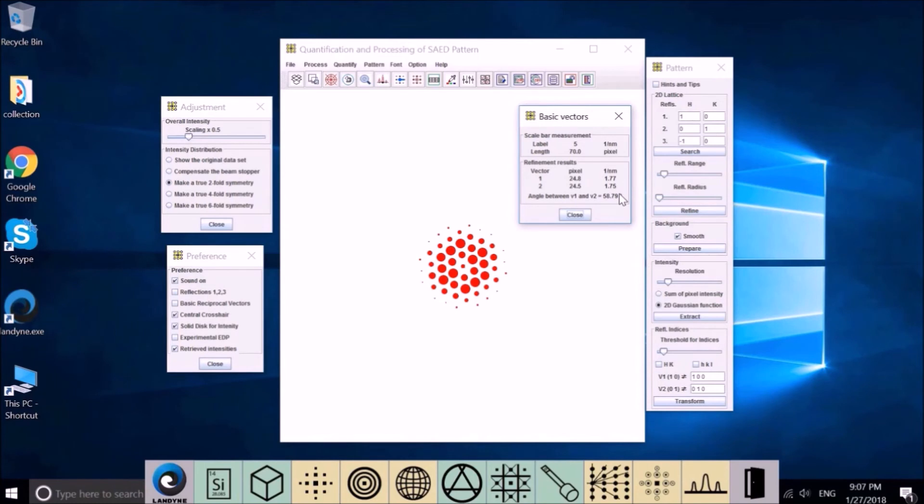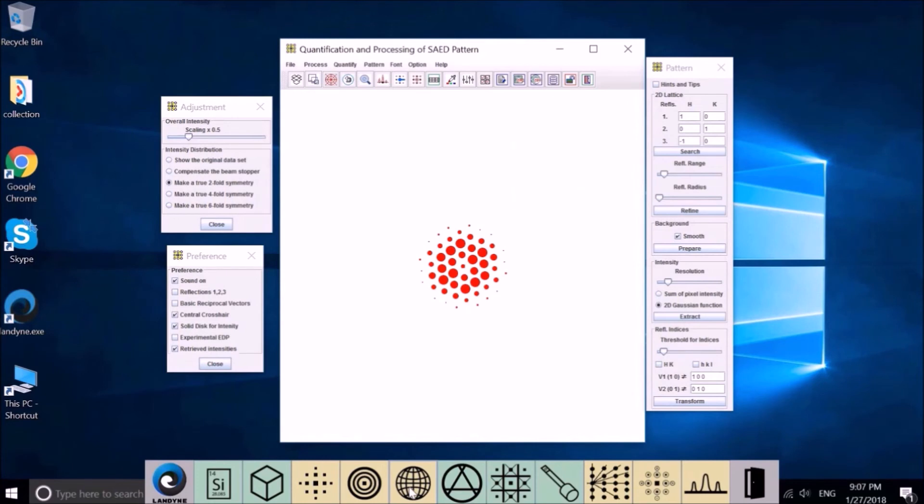And the angle between them is 58.79. It's not 60 degrees. That's why we said it's pseudo-hexagonal. But it's not really six-fold symmetry.